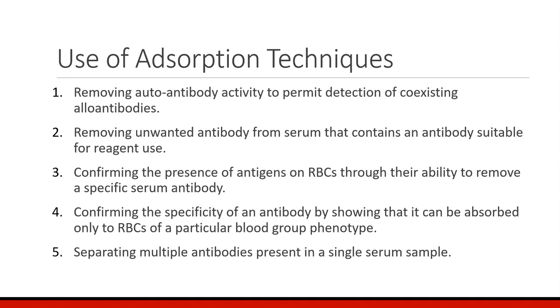And I know this is really, really high upper level stuff, but I want you to know it. It's important for you to at least know the basics of adsorption techniques and the variety of ways that this technique can be used in blood banking.